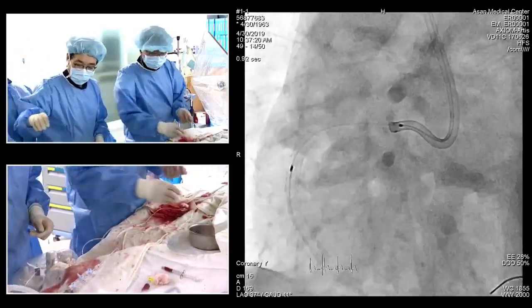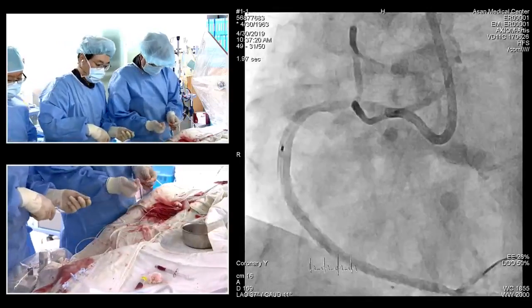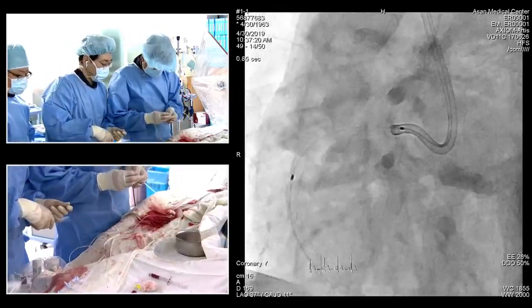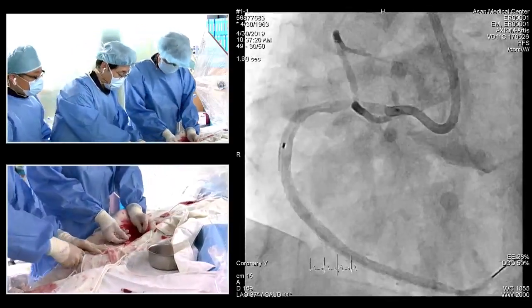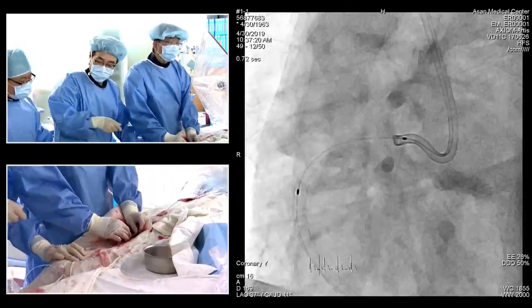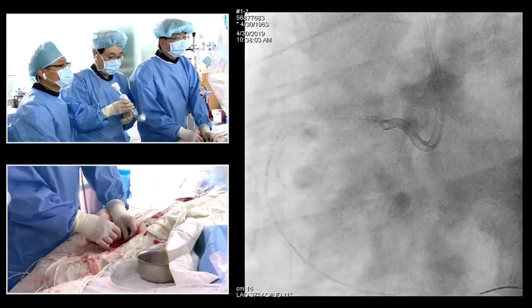So AL1 sometimes makes it difficult to adjust the precise location of a stent in the RCA ostial area, so it is technically challenging. At this moment, we can change the guiding catheter. However, I don't like to take the troubleshooting just to do it.